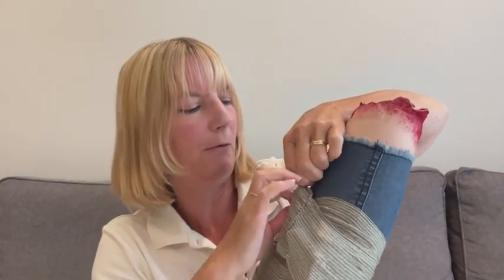So you need to go over like that, and when you get to the end of this particular one, you have a bar, and that bar can then be hooked over a couple of bits of the dressing, and then they can be secured. They just clip over through a couple of pieces of dressing and clip down to clip it in place. You can also use the bar to tighten even further if you need a sort of tourniquet option, but it isn't as strong and won't generate as much force as a full tourniquet. So you would secure it like that. So that would be a firm pressure dressing.